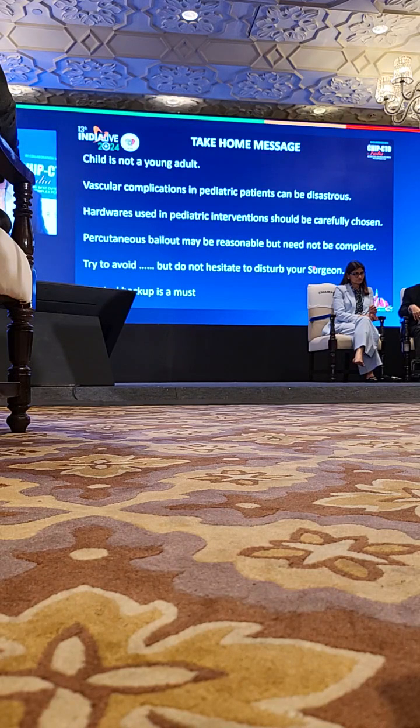Once the catheter was there in the iliac artery, possibly I should have sent the child to surgery. But in the adult population we have tried to pull out, as was shown in the previous case. But this cannot be true with pediatric patients. So this is where I went wrong, and try to avoid it, but do not hesitate to disturb your surgeon. Surgery backup is a must.